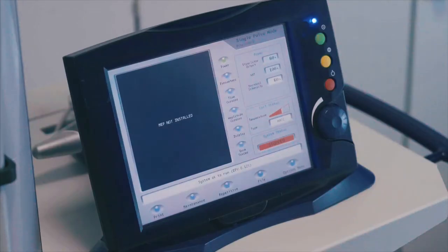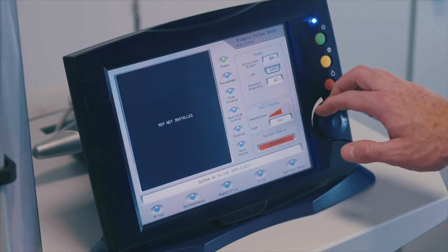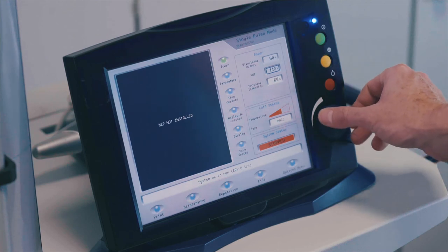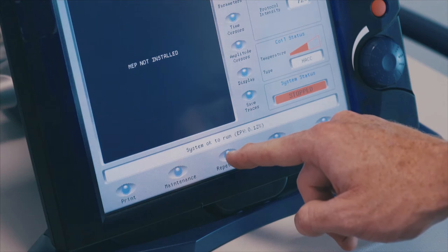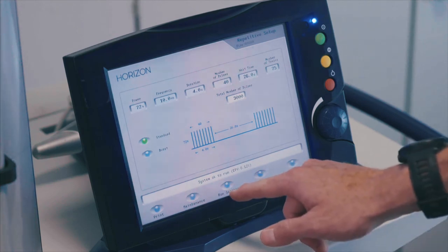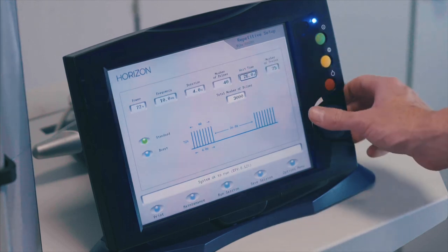From the single pulse screen, select the percentage MT window and adjust to 120%. Select the repetitive button to set up your treatment protocol. Check the preset protocol and adjust if necessary by selecting the required window to adjust.